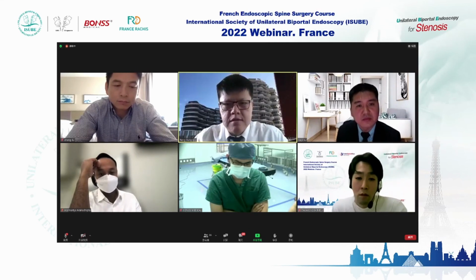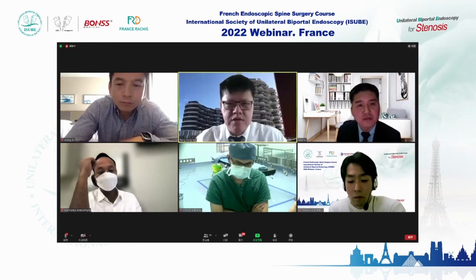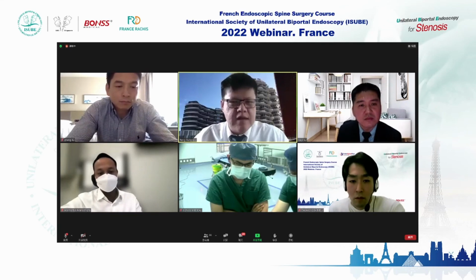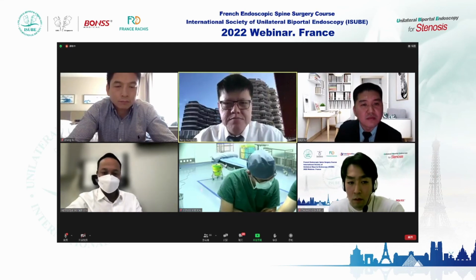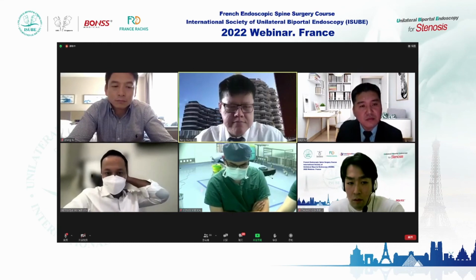Sometimes you just have to spend more time, so allocate more time for yourself and try not to give up. Do not do something like T10 to pelvis after you learn the scope. If in your first 10 cases you stress yourself and give up, you get very disheartened. So choose a discectomy initially, and then subsequently move to the harder cases.